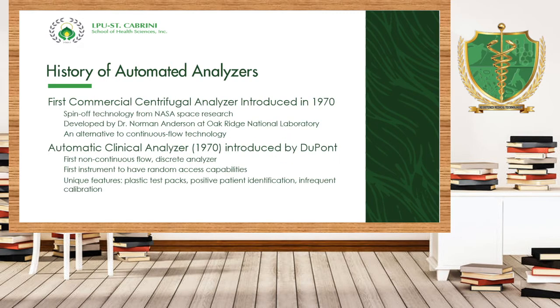Okay. Of course, we have here the first commercial centrifugal analyzer, which was introduced in the year 1970 by NASA Space Research. The downside of this first commercial centrifugal analyzer is that it has a significant carryover problem, which is costly because of reagent waste. Again, when we say carryover, it is the possibility of contamination from one sample to another because of the failure to pump or to cleanse or rinse the rods prior to the next sample.